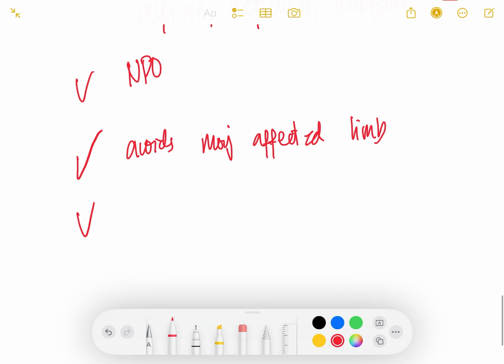And then, we have to put pressure. Okay? Dapat may pressure doon sa puncture site or kung saan tinusok si patient to promote clotting or prevent bleeding. Okay? Para magtigil yung pagbe-bleed. We have to put pressure on the area. So, ito yung mga importante when it comes to coronary angiography.